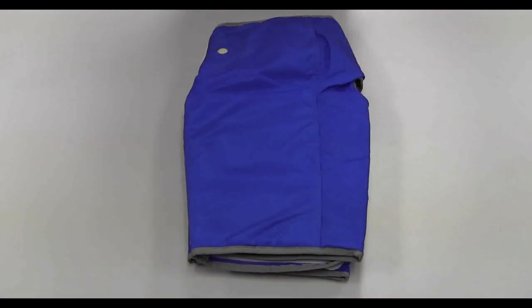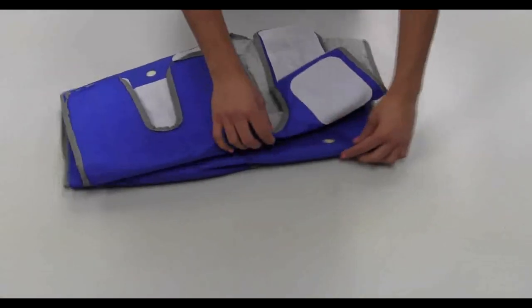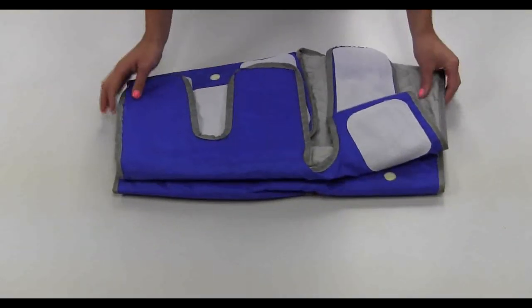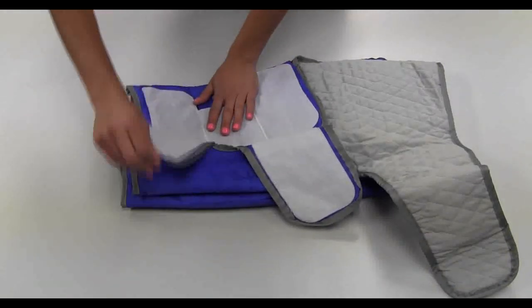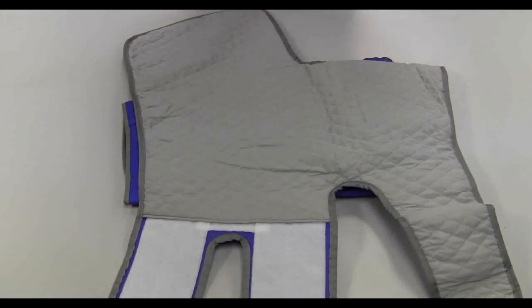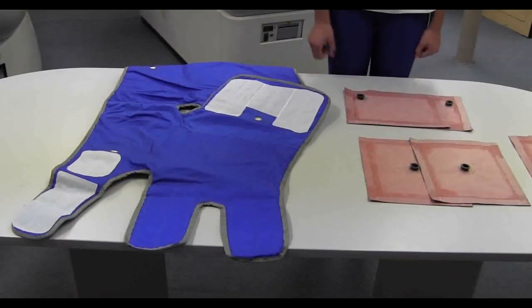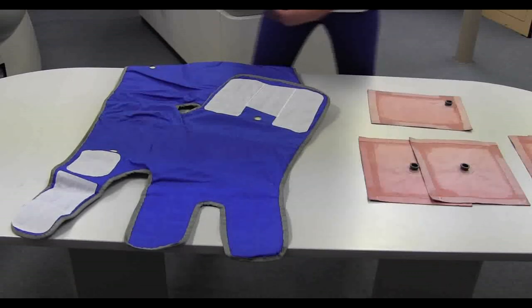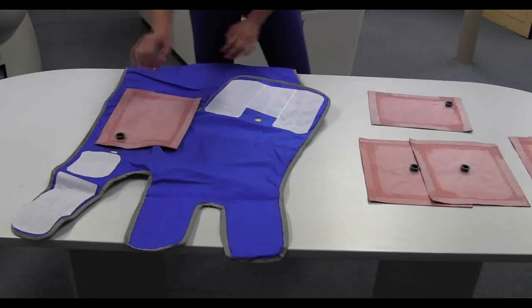To assemble the cuffs, unfold the cuff and fold it over once again. Undo the hook and loop binding, unfold the cuff, and set it in place. Position the cuffs, aligning the bladder inlets with the cuff inlet openings.